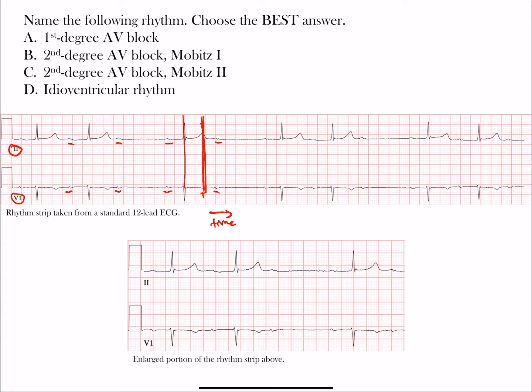We have a few different types of blocks to look at, and then there's one that sticks out: the idioventricular rhythm. Let's tackle that one first. This is a standard 12-lead ECG with an enlarged portion to see the smaller boxes. Idioventricular rhythm is a rhythm originating within the ventricles, meaning the rate is often between 20 and 40 beats per minute — a slow rate — and the QRS complexes will be wide, at least 120 milliseconds in duration.